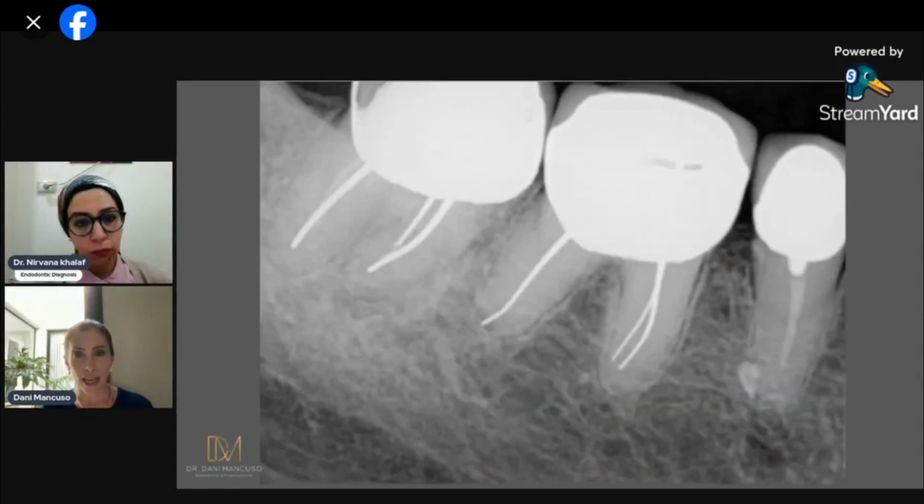In a case like that, when the patient has pain in every single tooth, and you do all the tests possible that you can perform, like percussion, palpation, you check the periodontal pocketing, and you don't know where the pain is coming from. So let's start with what we can see then. This canal is a bit short.